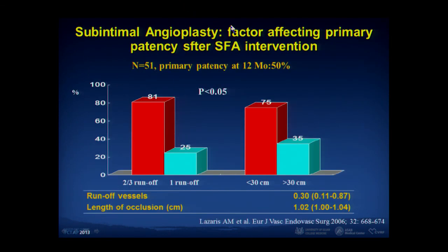Anyways, in SFA intervention, below knee lesion care is very important. The runoff vessel influences the vessel patency. So if you treat the SFA lesion, you must also care for the below knee lesion.